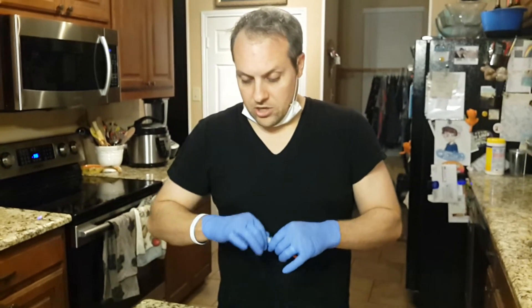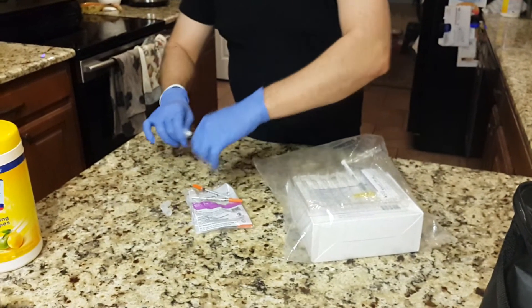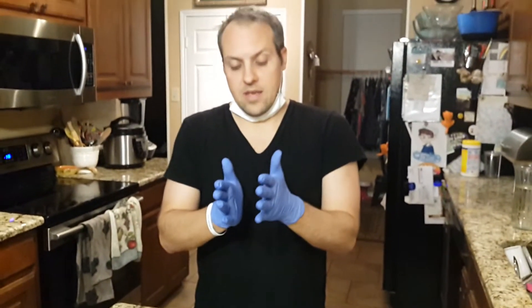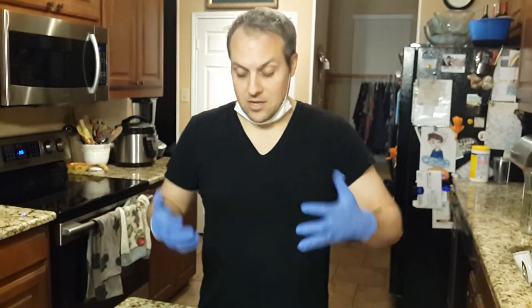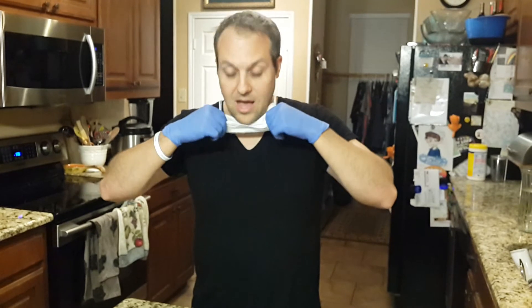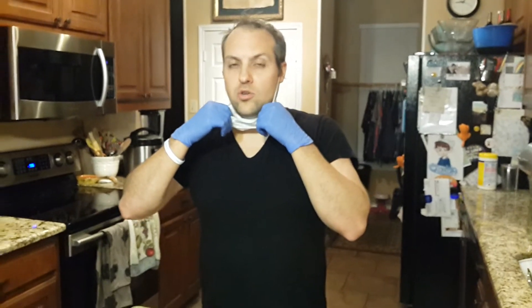Take the caps off of the insulin syringes. If you get sterile gloves that are individually packaged, you can actually roll them on the paper itself so it's all sterile — that's a really nice option. Let me show you how I extract the Kineret into three different syringes. If you're on 0.30 you're probably going to get two and a bit syringes out.